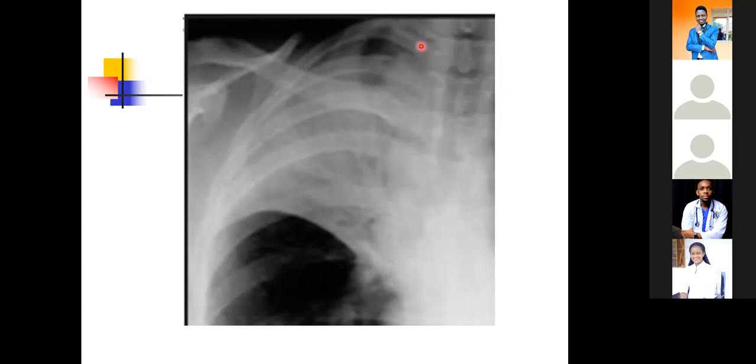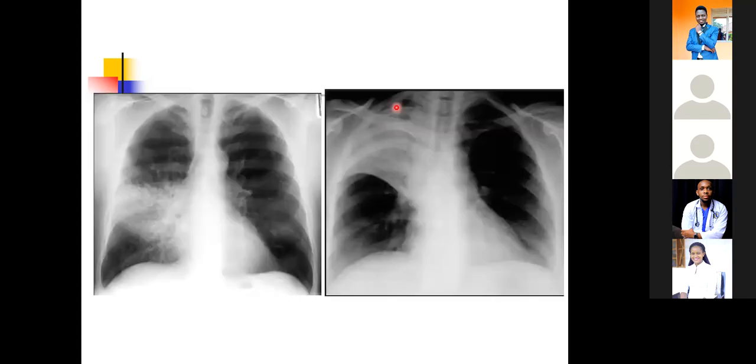So you cannot appreciate that there is a boundary here. We can only appreciate it right here because this area is black, this one is gray, and there's that clear boundary. I hope I have tried to answer your question, Mr. Kintu.